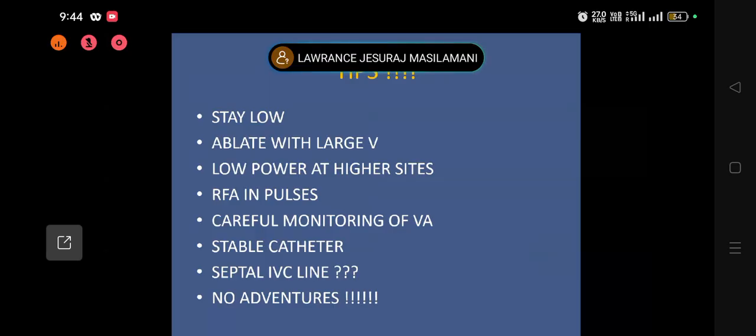You deliver safer, and if you feel like your ablation is not adequate, and if you go cephalad, you are going to cause AV block. Come out and tell your patient that this is a risky area. I have a narrow Koch's triangle. I've ablated whatever I could. If it recurs, I will do it again. That's no ego, nothing. You can always come back again with a prepared patient.